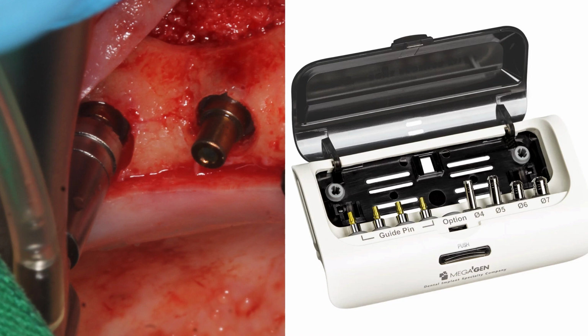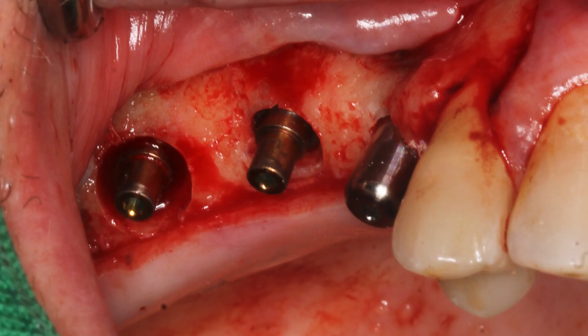So here's the actual kit in view, and now we have those cylinders in place, and with the rotary cutting instrument in action, you can see the actual neat profiling. The profiling not only has to give you enough space for the healing abutment to sit, you actually need to have more space than the healing abutment.